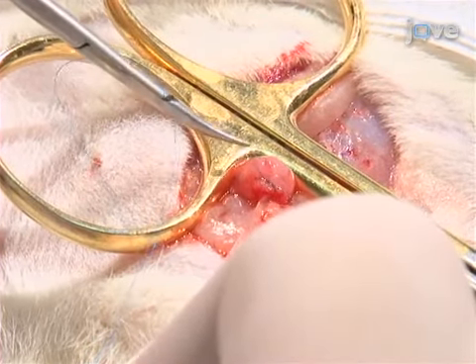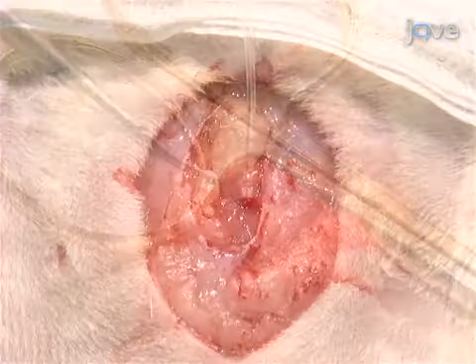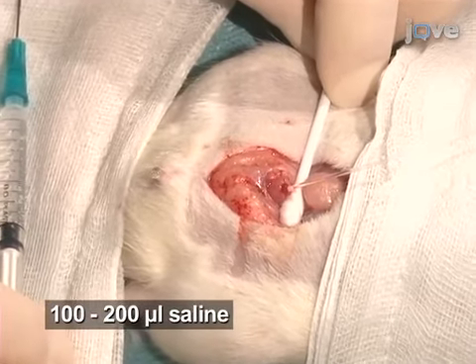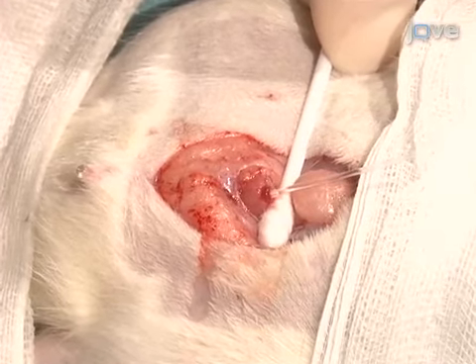Then, gently pull the catheter outwards until the cuffed tip is directly under the suture. The piece of 18-gauge catheter is pushed towards the suture to prevent leaking. Check for leaks between the catheter and bladder with a gentle infusion of saline. Tighten up any leaks with additional sutures.